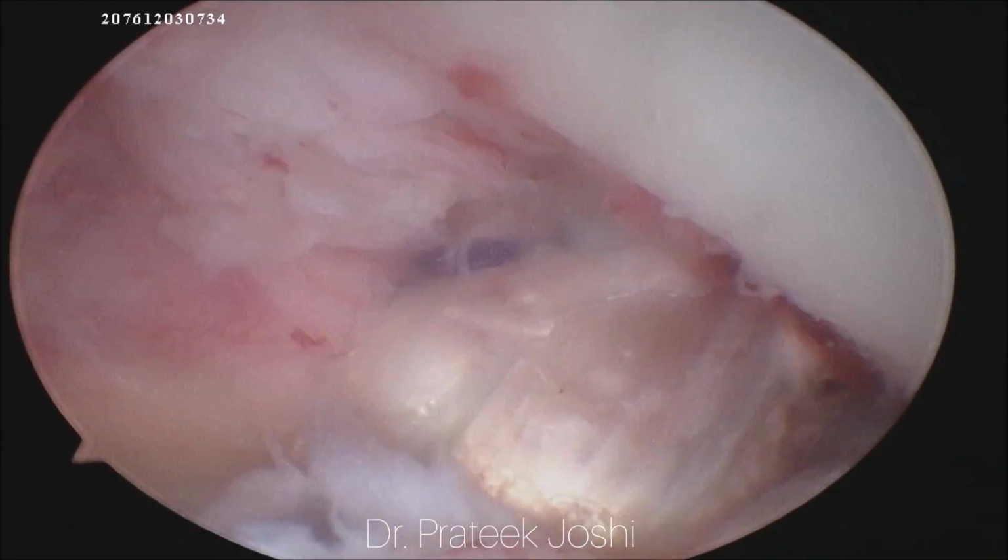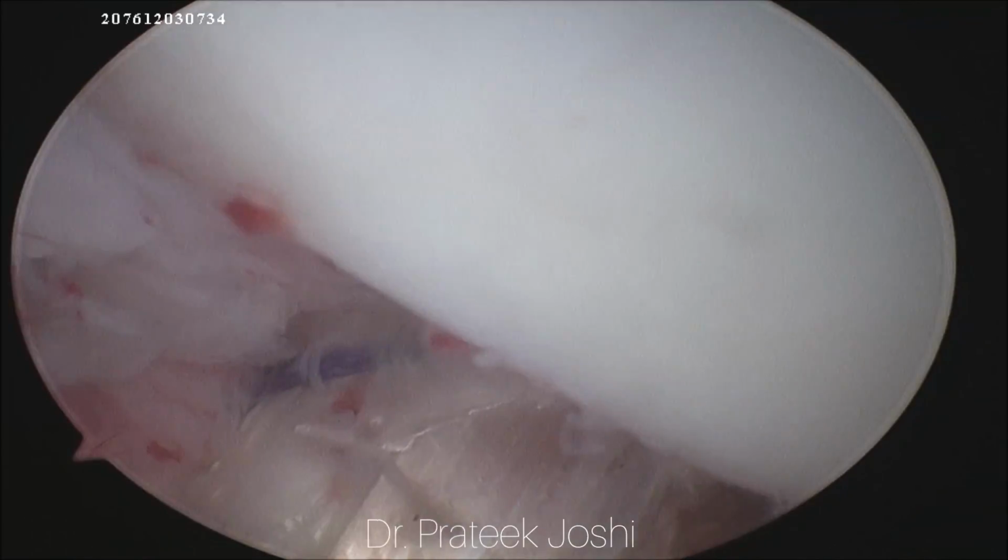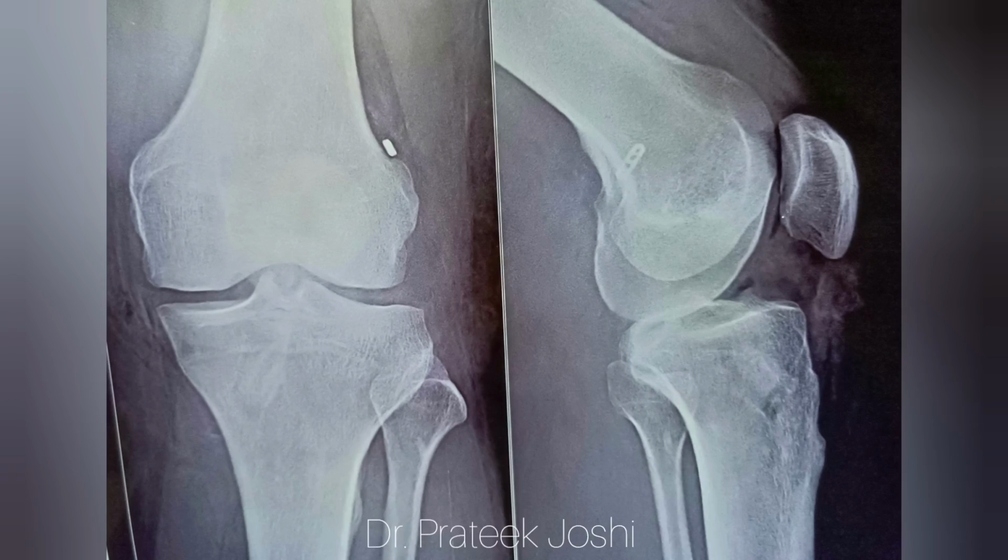We are going to follow the standard ACL with meniscus repair protocol, and this is the post-operative X-ray. You can see the beta TCP screw with the tunnel in the tibial end, and endo button is sitting flush to the lateral cortex of the lateral femoral condyle.